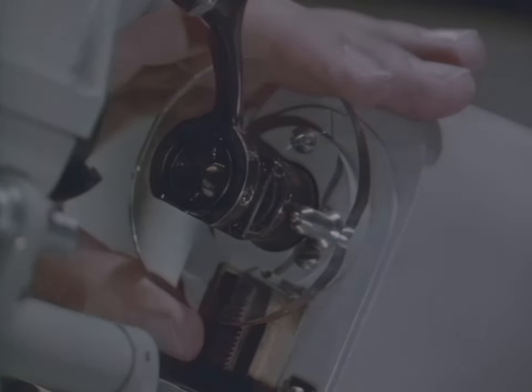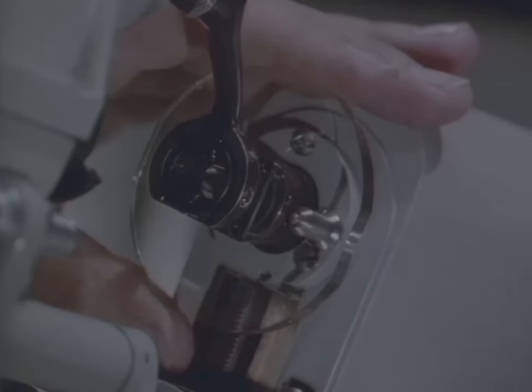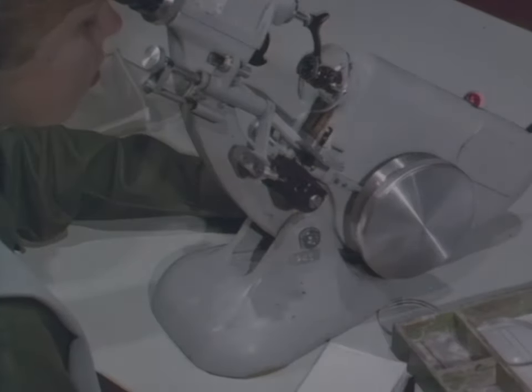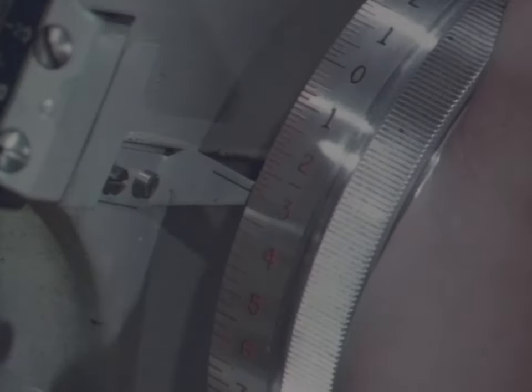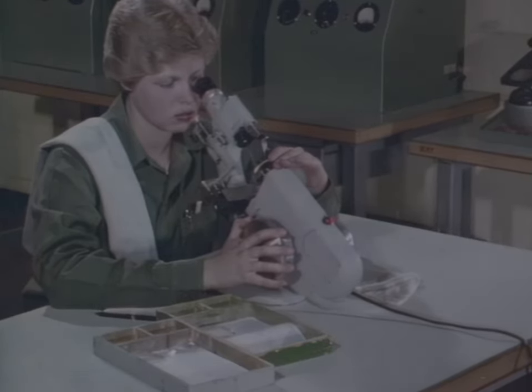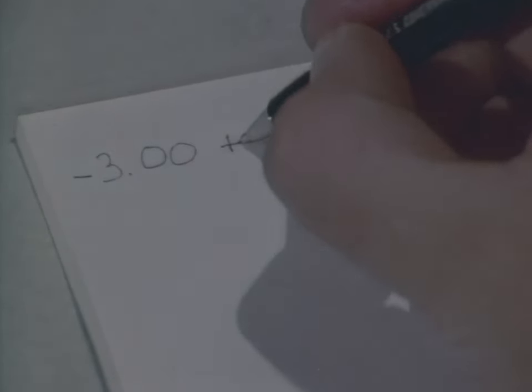Center the lens. Read the power wheel setting — this is the spherical power of the lens. Write it down in plus cylinder form. Next, rotate the power wheel farther in the same direction until the broad lines come into focus. Center the lens. You've gone from minus three to minus two, or one diopter in the plus direction. Therefore, plus one is your cylinder power.